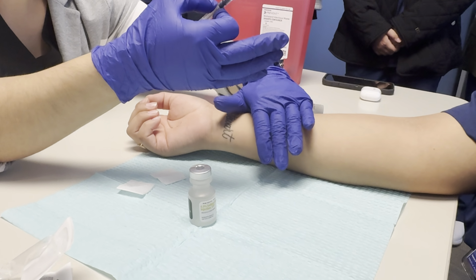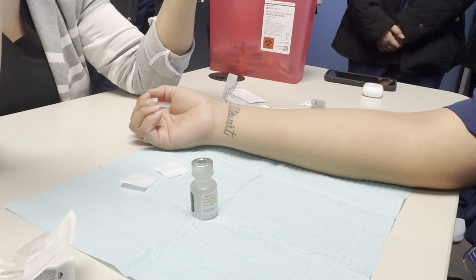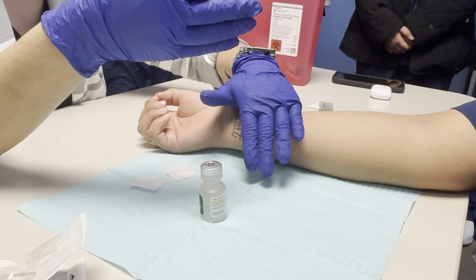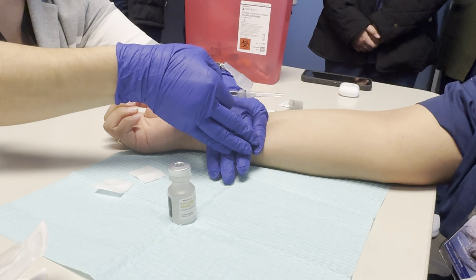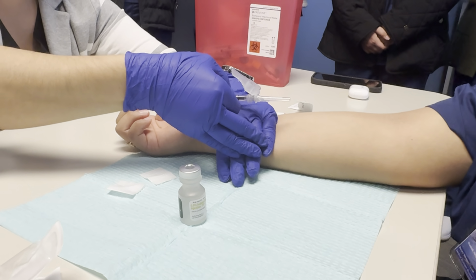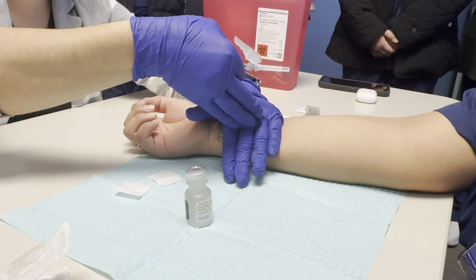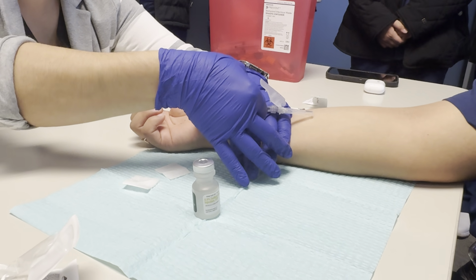So if I put my hand right here and I anchor, it means you're stretching the skin. Come around here. You cannot see anything. I can't see you. That means they can't see me. We're going to come around. If we go on the bottom part, I already added at least a 20-degree angle right here. Right? So if we want to go superficial, if I have this, you still can't see, can you? You can? We anchoring it down. That's still giving me, look at that angle.